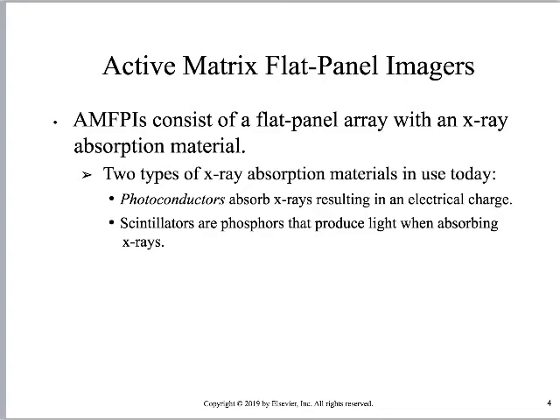But if the absorption part is damaged, you're going to get weird picture artifacts, right? So I like this illustration here. And then in this next illustration on the page right here, she's zoomed in beneath the absorption layer into the active matrix layer, and she's showing us these thin film transistors, right? So we're going to spend some time on just this illustration right here.